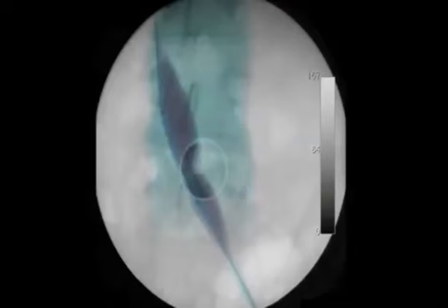This is a guide wire inside of the vein. This is a fluoro image now with only x-rays. It's not ultrasound. This is the spine, the spinal column going straight up and down. And at the lumbar 4, lumbar 5 interface is where the iliac vein divides, and here you see a balloon at that L4, L5 space, and you see a waist in the balloon.